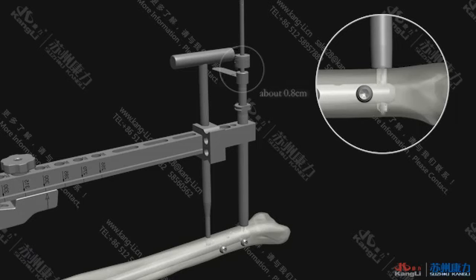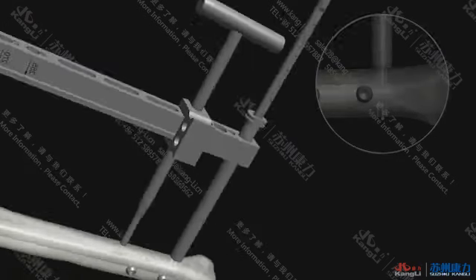Then continue drilling until the contralateral bone cortex is drilled through. Remove the phi 4.0 inner sleeve and phi 4.0 drill bit. Keep the outer sleeve closely contacted with the bone cortex and insert the guide depth gauge to measure the diameter of the bone.